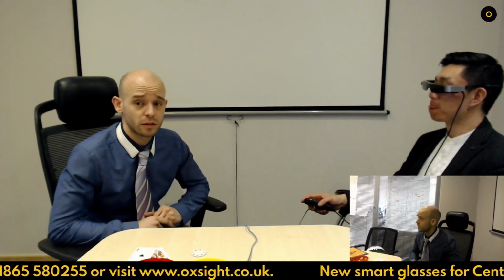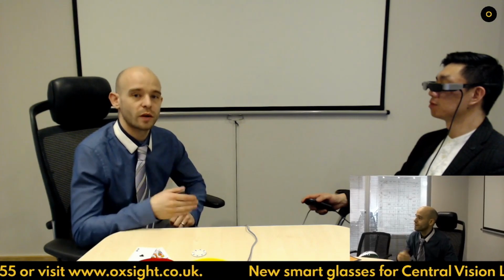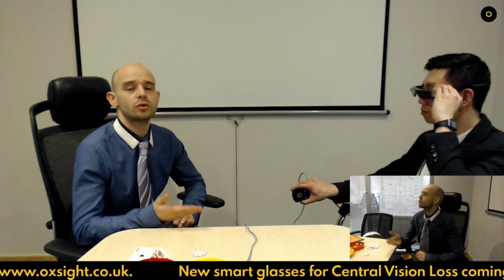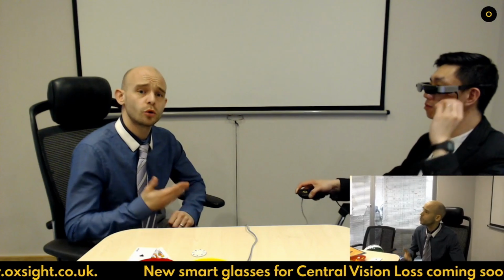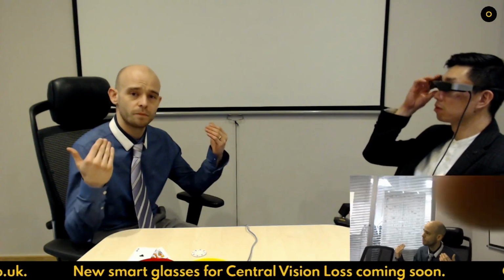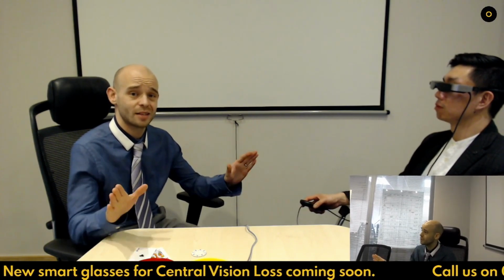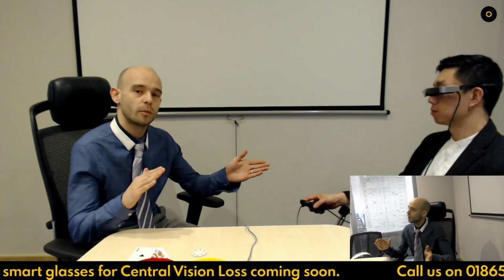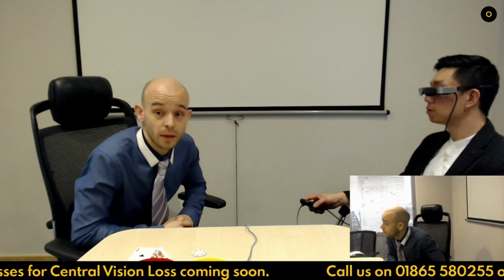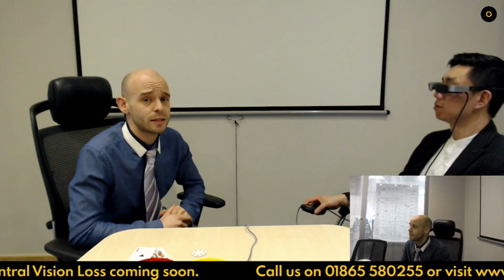Perfect. So that's one of the things that Ethan's highlighted here is really good, because one thing you'll notice, especially if you're going into a bar or restaurant where there's that mood lighting, you can give yourself a little bit of a light boost. But in the same respect, you want to do those things that you are doing already, in the sense that you put yourself with a light behind you. So if you've got a window, you want to sit with your back to the window, so that you're looking at people with natural light being presented onto them. You get the best image that way. If you're looking at someone with a window behind them, then you'll also see a little bit of that highlighter that we saw when we turned the brightness up a moment ago. So again, really good for if you're going into that mood lighting that a lot of places seem to have these days.